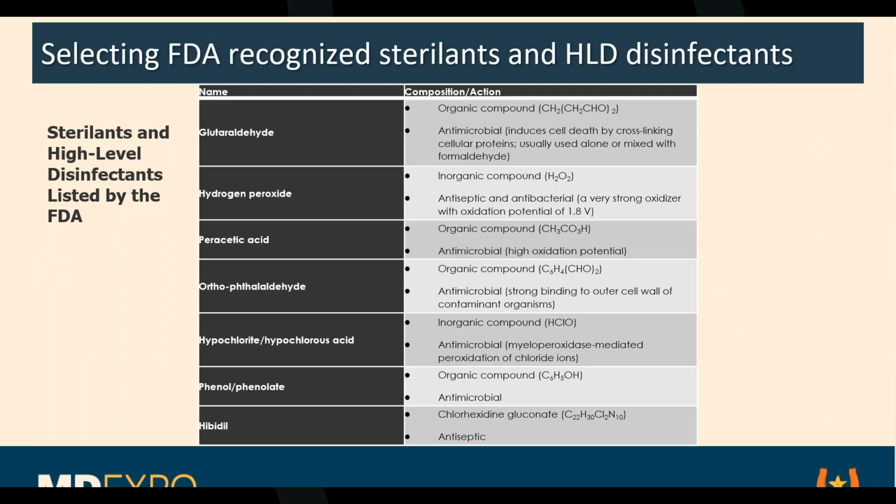One of the reasons is you're watching out for your probes. We see at our facility, we repair hundreds and hundreds and hundreds of probes every month at Esoterra. And we have probes coming in from hospitals that clearly have been subjected to chemical processing that either killed a transducer or made it look very, very different than what the OEM had hoped for over the life cycle of that probe.